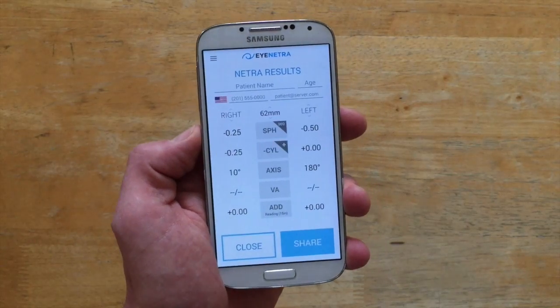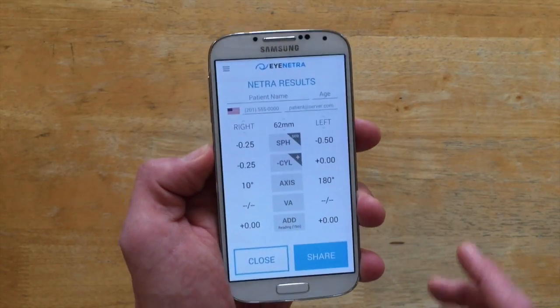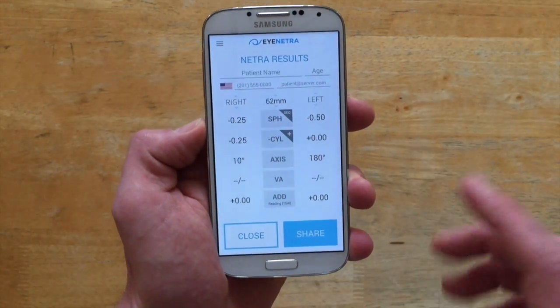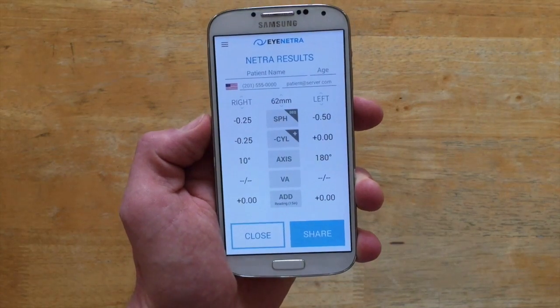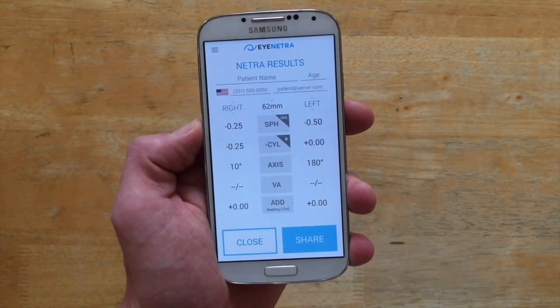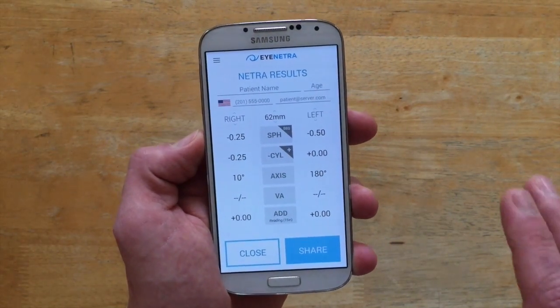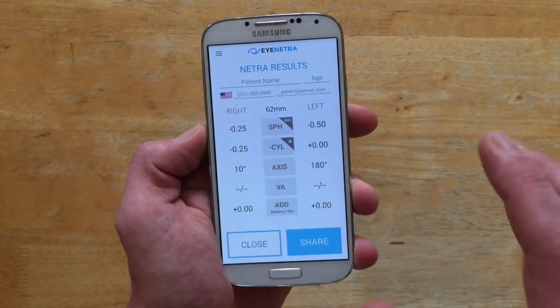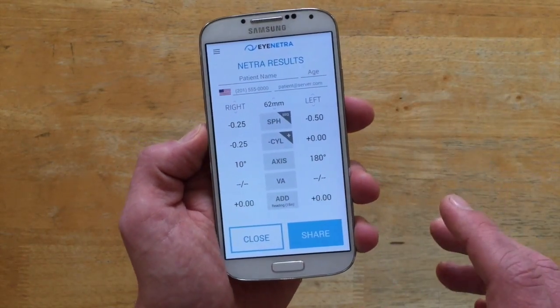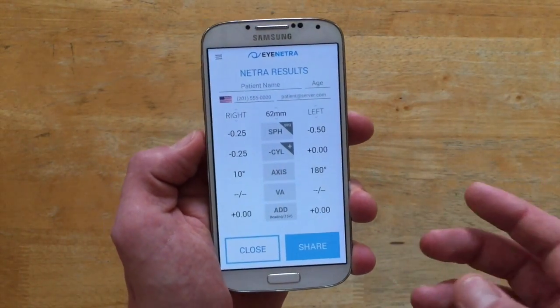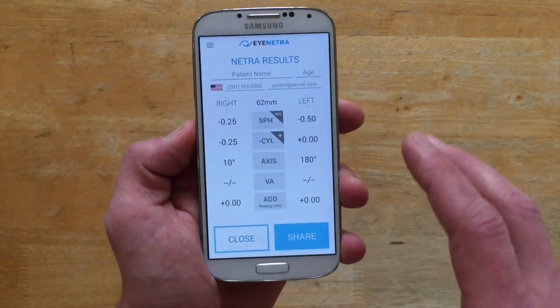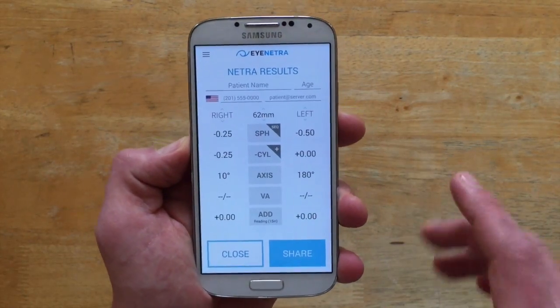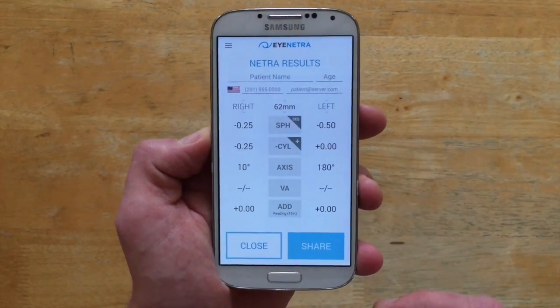Hi everyone, Greg here. Today we're going to take a look at the results screen for both the Netra and Netrometer applications, and more specifically we'll show you how to use the results screen to not only store all the necessary patient information you need as a provider, but also how to send that final prescription information to the patient using just the smartphone.